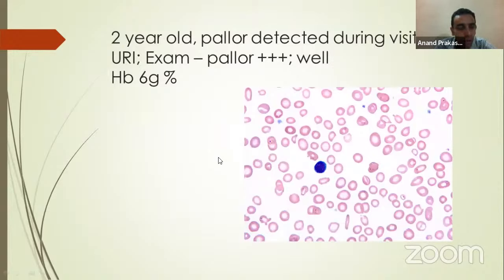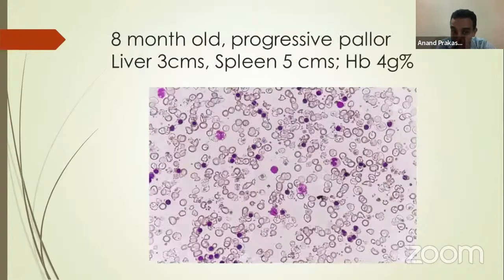Okay, somebody wants to do iron studies. I presume that's electrophoresis, sickle cells. Okay, a lot of answers coming in. Electrophoresis, right. Okay, good. So we will come to some of those answers. We'll tackle this patient now. Many of you are thinking along the right lines, and we'll move to the second case.